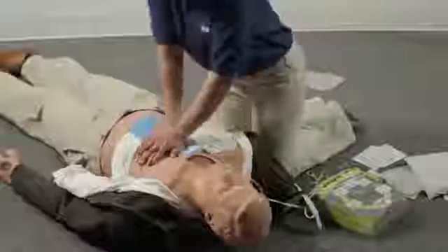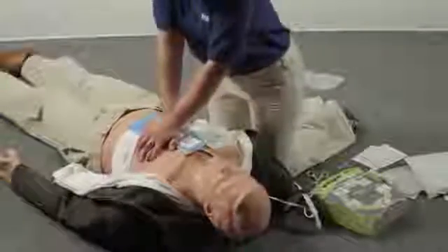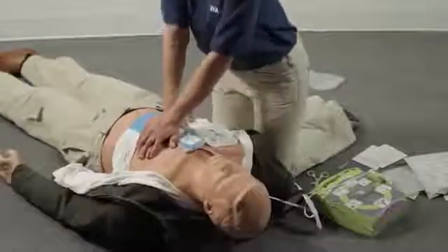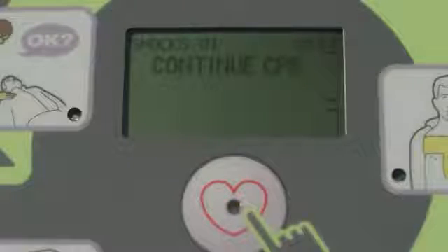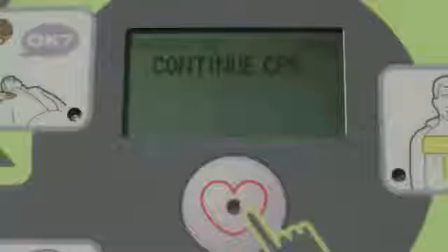If you don't start CPR right after being told to do so, you will be prompted every 10 seconds until you do start. And if you stop for longer than 10 seconds, the AED Plus will tell you to continue CPR every 10 seconds until you resume CPR. Continue CPR.